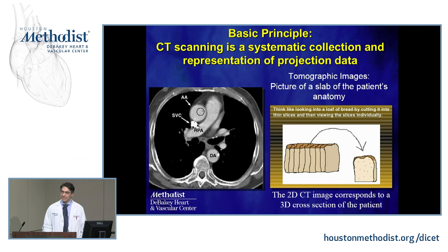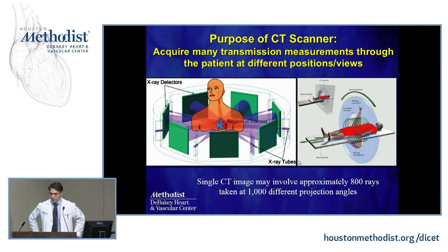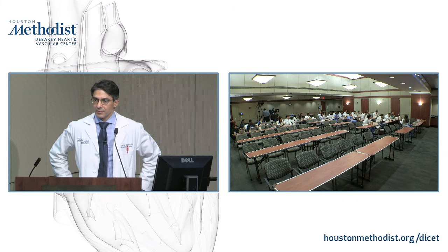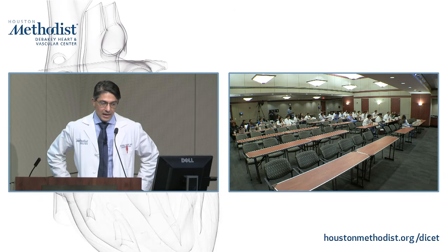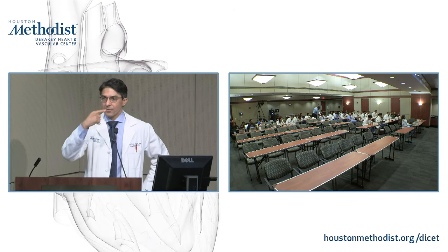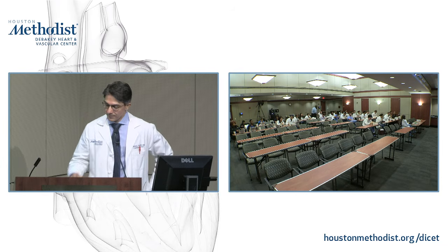Once we see, yes, sir. So in a regular x-ray, you send the x-ray, pass it through the tissue, and you have it in a receptor here. On a detector, yes. In the CT then, each of those yellow things are sending and receiving? No, one is sending, one is receiving. I'll show you the guts of a CT scanner on one of the upcoming slides. Okay. I'll show you that.